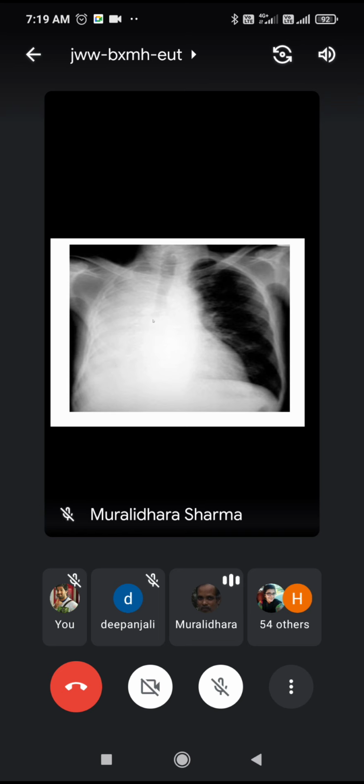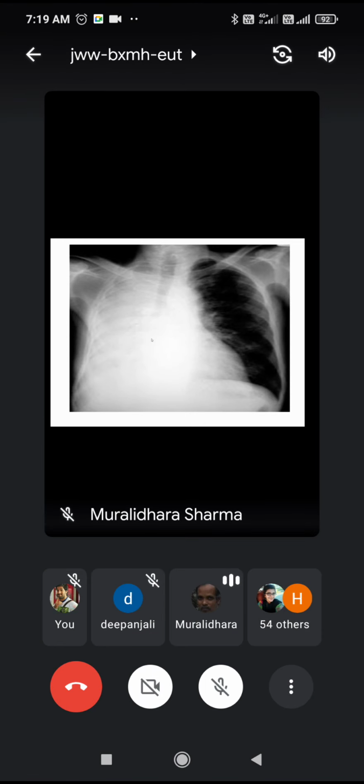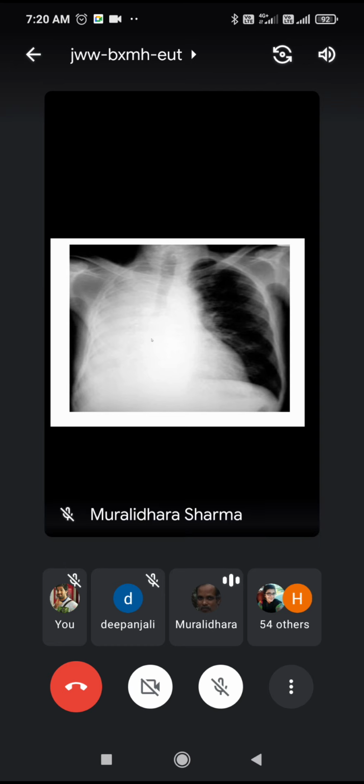Maybe there could be an obstructive pathology, a severe gross obstructive pathology in the bronchial area, and often this kind of bronchial obstruction is of a slowly progressive nature. Now, it may not be a foreign body. In an atelectasis produced due to obstruction, of course exceptions could be there, but usually we suspect some tumor pathology rather than a foreign body.